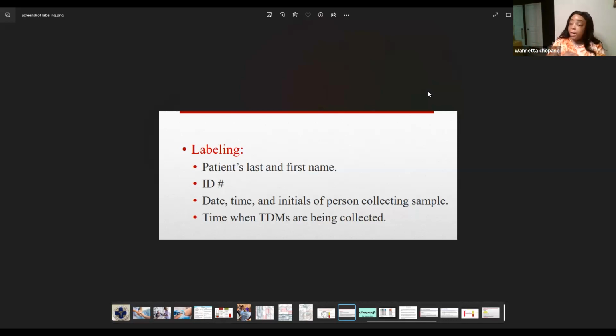When you put it on there, the patient verifies that you have labeled the specimen with his or her name. But you do need to write your initials. For me, I write my initials. I write the date and the time. Sometimes the labels will already come with the date, because it's tied to when the patient was in there when you print out the labels, but they don't know the time. So you would write the time. It's very important to put the date and the time.